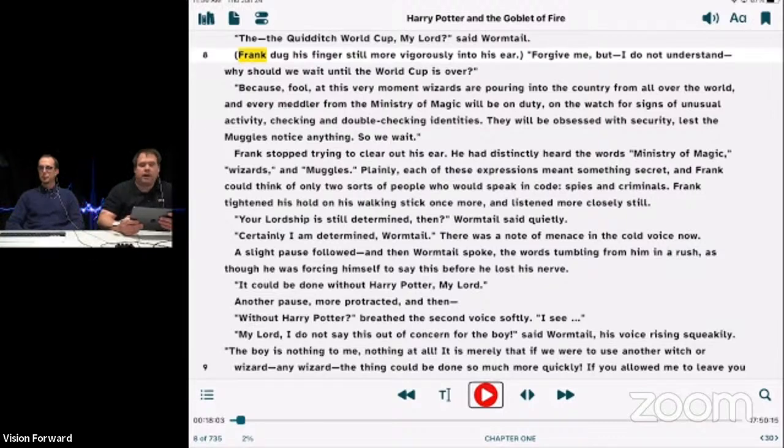While it's reading, you have all of these different ways that you can adjust and move by. We can move by 30 seconds, by page, by sentence, and swipe up or down with one finger to adjust the value. So you can really drill down on how you move while it's playing it back.